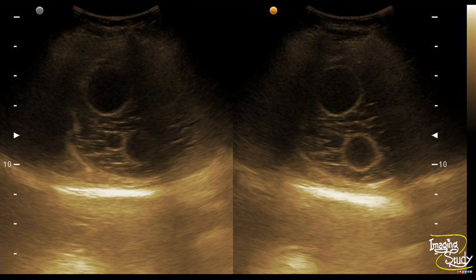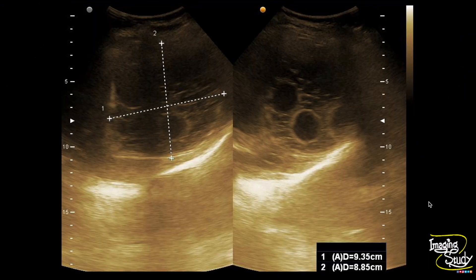Here is the picture of this cystic lesion. You can see multiple cystic structures within this structure forming a typical honeycomb appearance. This is the infective state of echinococcal cyst or hydatid cyst. The cystic lesion measures about 9.3 cm x 8.8 cm.